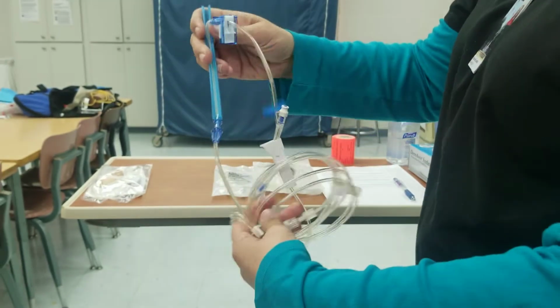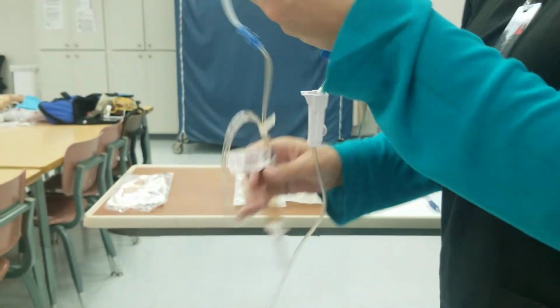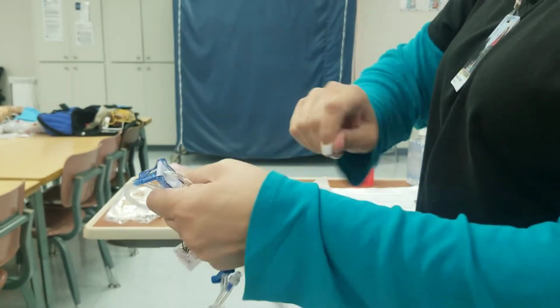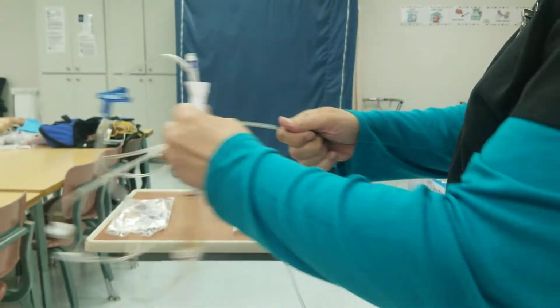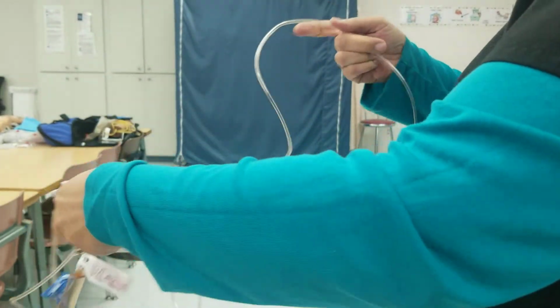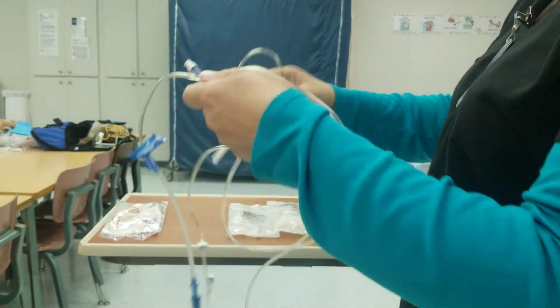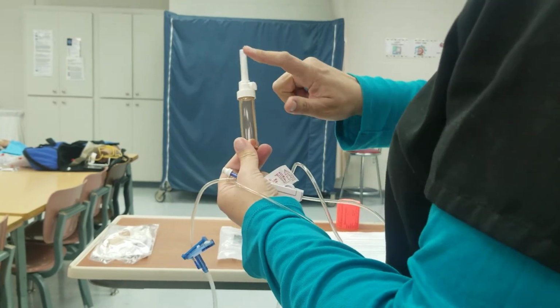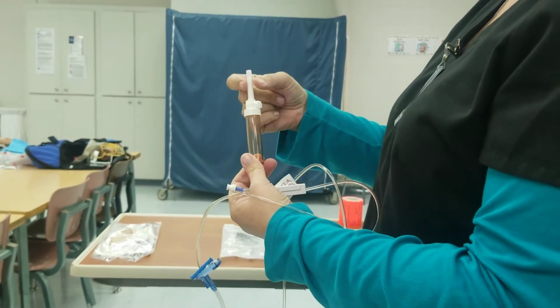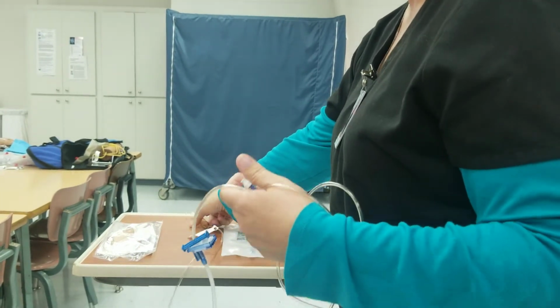All right? We can take off this blue right here. And like I said, this tubing's for this Alaris pump. Y'all are going to get to practice this. Kind of straighten it out. And this is your drip chamber. It's flexible. This right here has a cap on it. It has to remain sterile at all times, and I'm going to show you how to access your normal saline with that.